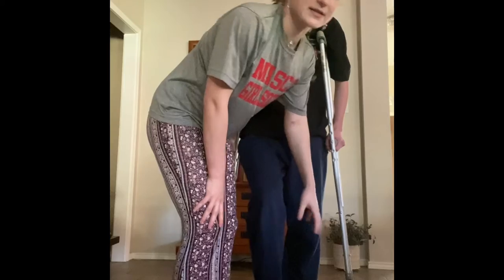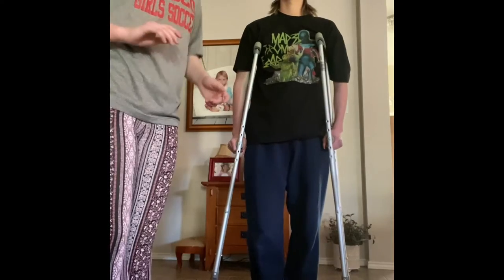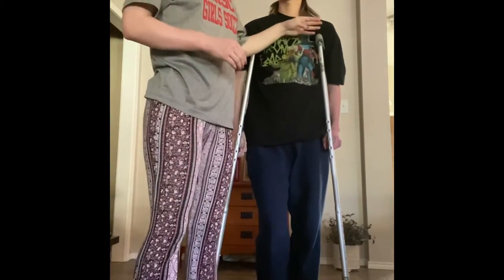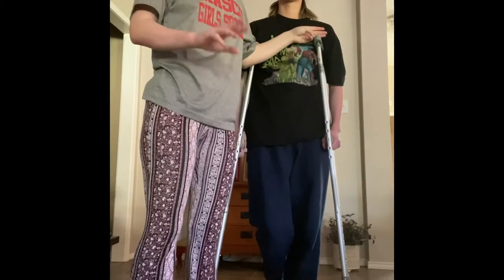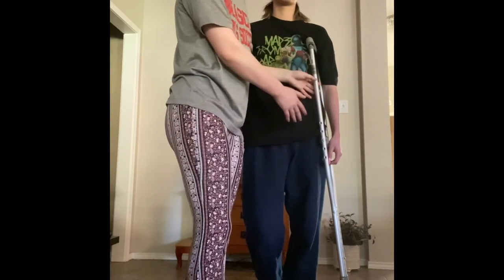The distance from the toe should be about six inches away from the bottom of the crutch. A key factor with your patient and their crutches — make sure they're comfortable. Two to three finger distance from the axilla, and the hand grip fits perfectly. You want the arm kind of hanging. See how if she lets go, her arm is hanging more comfortably.